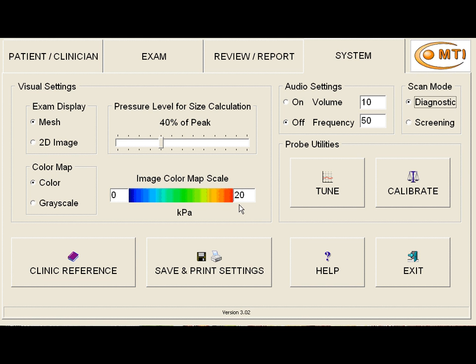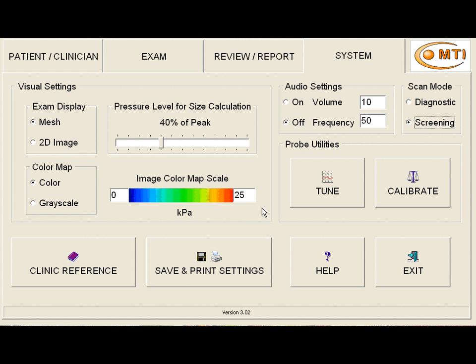And this would be good to look at one particular lump that we want to characterize as far as how many peaks it has and what its size is. But to screen an area, to look in the general area to confirm whether we have a true mass in that area or not, 25 is a good number.